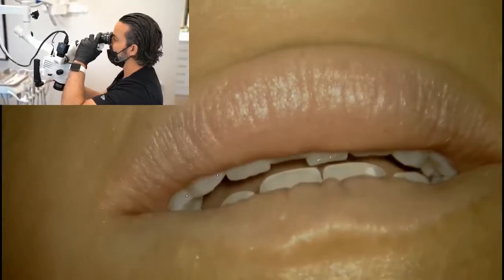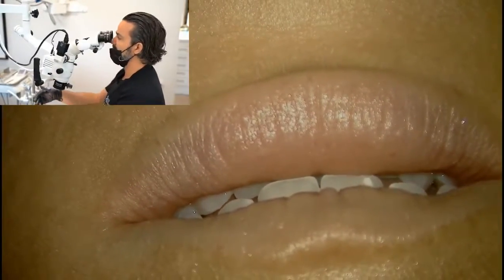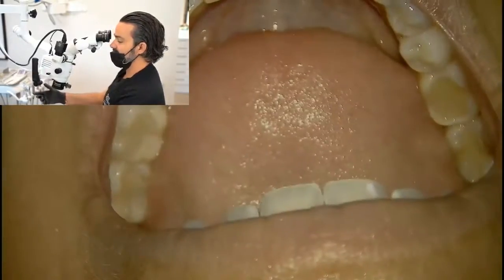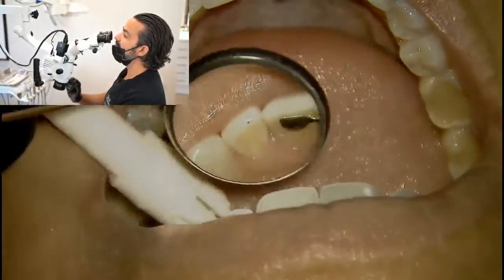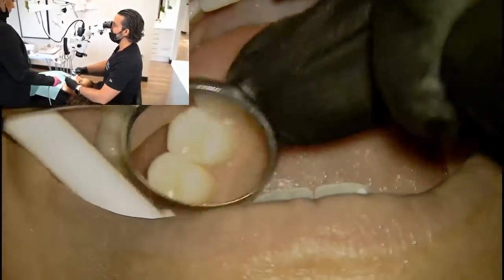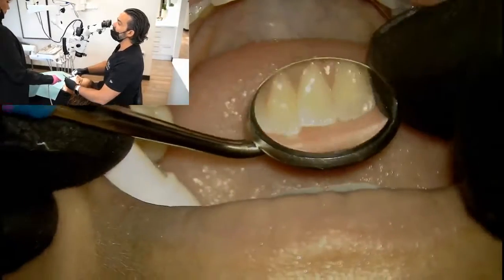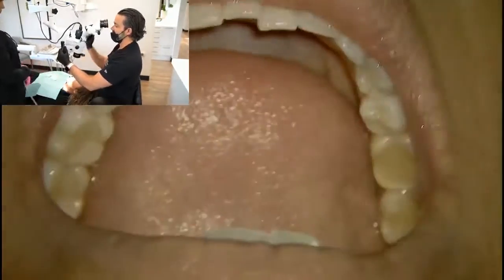But when I'm in 12 o'clock, especially as an endodontist where everything is mostly occlusal access or lingual, I just use my mirror and I can come in the same position, whether I'm looking at the maxillary or the mandibular arch. So let's get me back corrected.